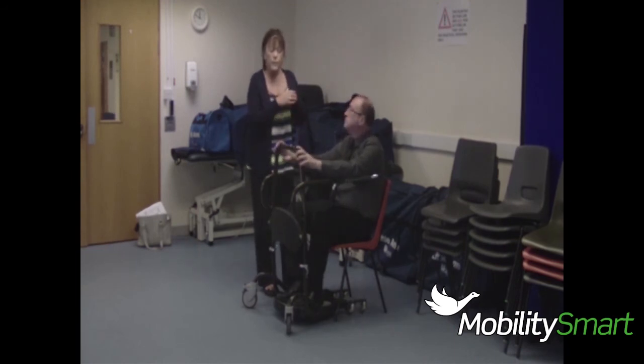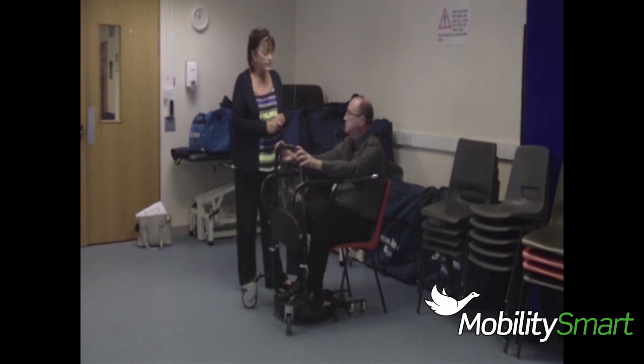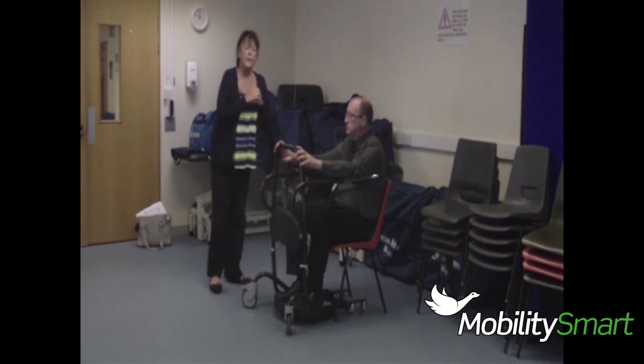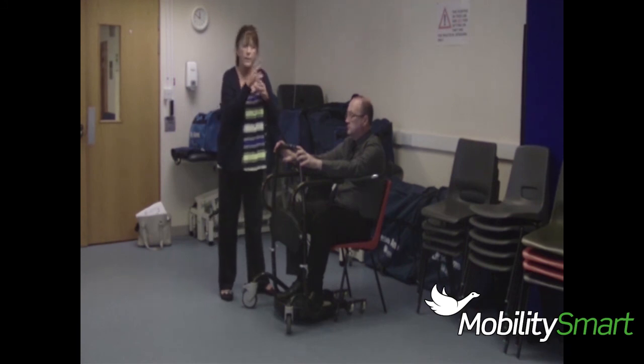The Cricket can also be used as a physio tool. So if we've got a client that needs to practice their sit to stand, we can put it around them like so with the brakes on, and they can practice that sit to stand to strengthen the muscle groups. Okay, the company does offer self-assessments and so on with occupational therapists in the community. And the big thing at the moment is the fact that the Cricket is used by one carer. Whereas with lots of transfers, you'd need two carers to get somebody up out of bed and so forth. Depending on the client, the Cricket you can use with one.